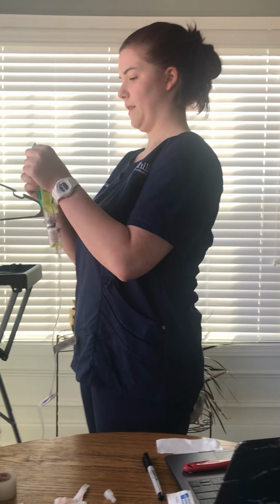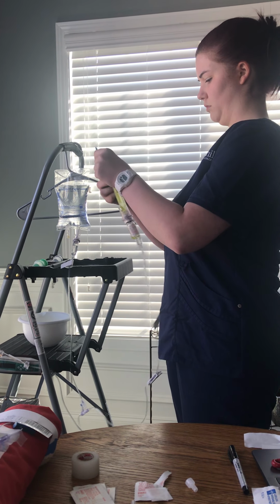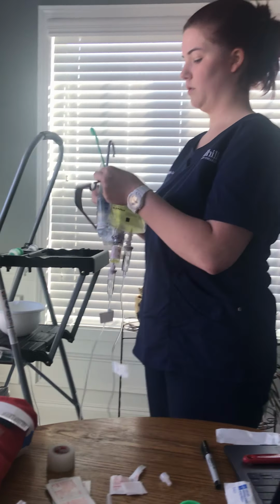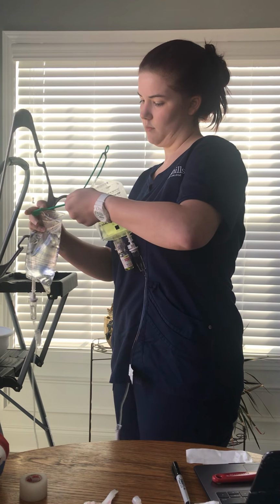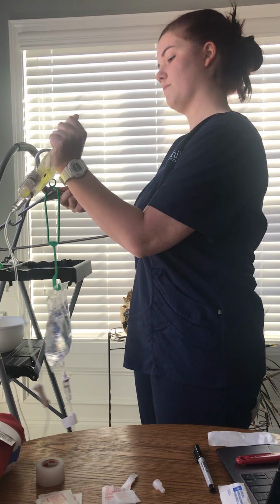Okay, and my green hanger is going to be used. I'm going to put the primary fluid below the secondary fluid here, the medication, so use this to hang it lower.